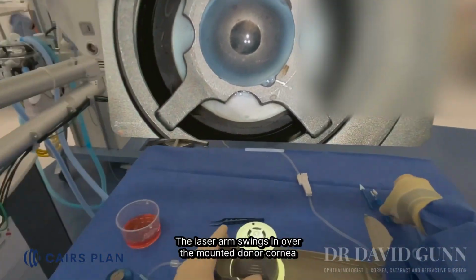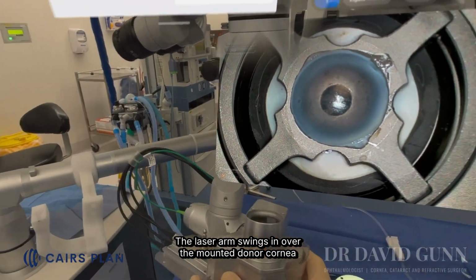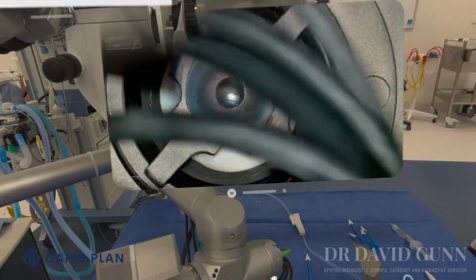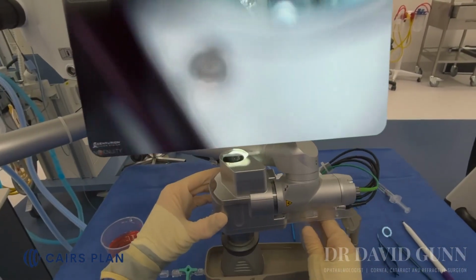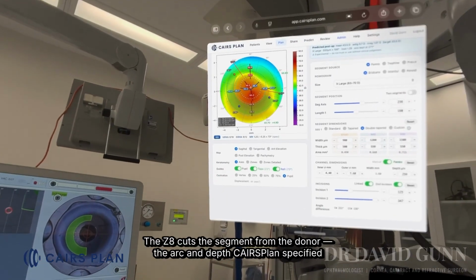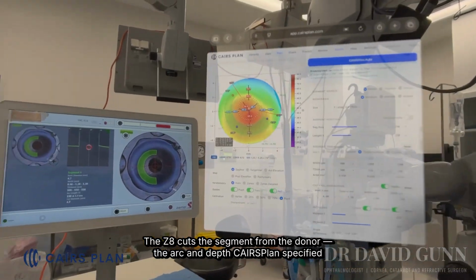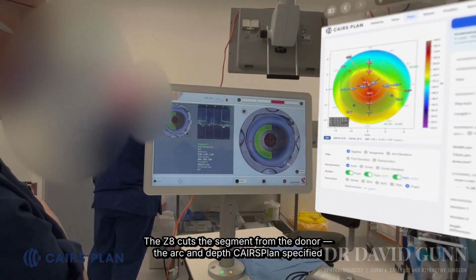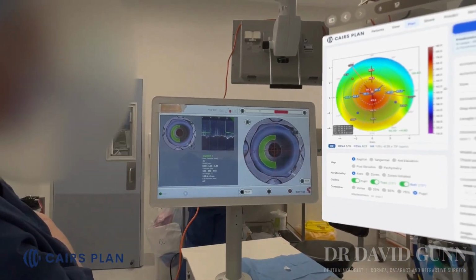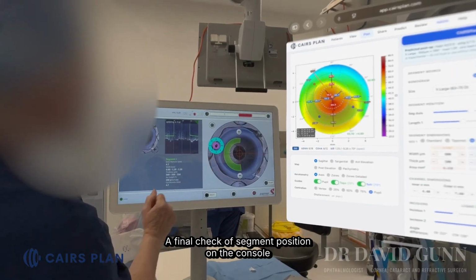The laser arm swings in over the mounted donor cornea. The Z8 cuts the segment from the donor, the arc and depth CAIRSPlan specified. A final check of segment position on the console.